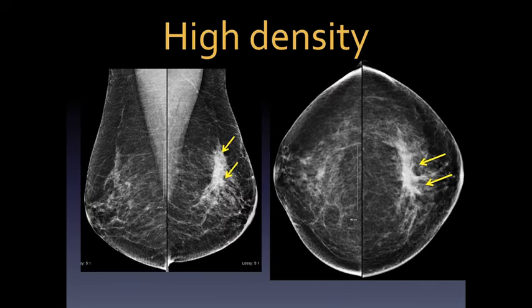Here is another example of focal asymmetry — in this patient it has developed over the past four years. By definition this is a developing asymmetry, and we investigate further with additional mammographic views and ultrasound. This turns out to be a small invasive ductal carcinoma. Developing asymmetry is an important finding — although uncommon, seen in only about 0.16% of all screening mammograms, it has a moderate likelihood of malignancy with an increased likelihood when associated with calcifications, architectural distortion, or being palpable. It accounts for 6% of malignancies in several large series.